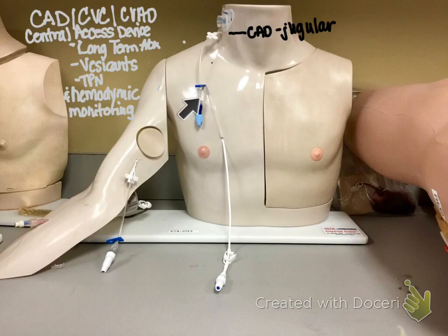Most of them have clamps, and because of this cap, you don't necessarily need to clamp that. I mean, a lot of people do, but you don't have to on these type of central lines. We're going to talk about the stat lock, but often you will see this sutured in, or attached here to the stat lock. And Baycare uses stat locks. I don't think everywhere does, so you may see some type of device holding this down, but a lot of times it's sutured in. So that's your jugular, and then there's not a picture of the subclavian, but you may even see one inserted in the subclavian as well.